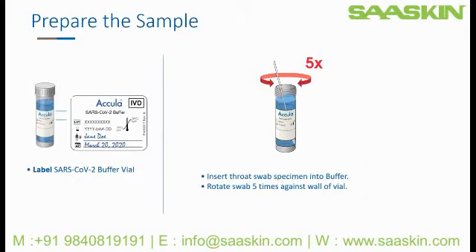To prepare the sample, acquire one SARS-CoV-2 buffer vial and label with the patient's name and collection date. Uncap the vial and insert the nasal specimen into the SARS-CoV-2 buffer. Rotate the swab five times, pressing against the wall of the vial.